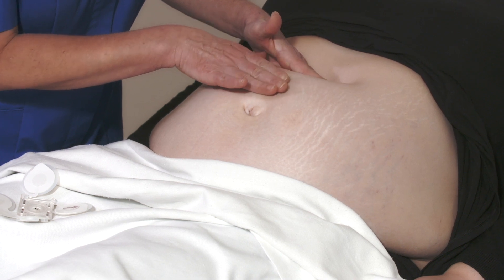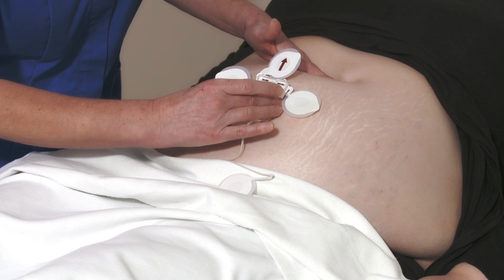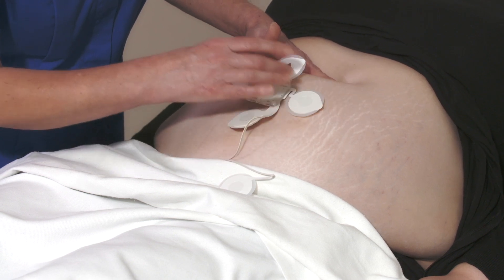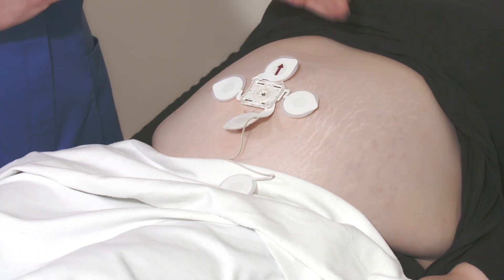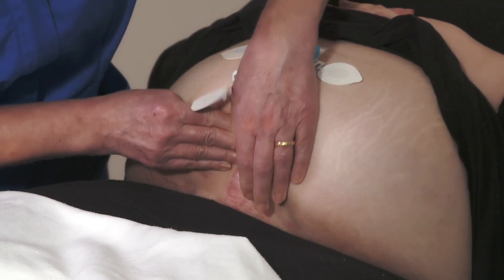Alternatively, position the patch plastic clip along the midline so that the edge of the top electrode marked with the red arrow is placed 10 centimeters or so below the fundus. In this patient, all three methods show that the umbilicus is not displaced significantly.